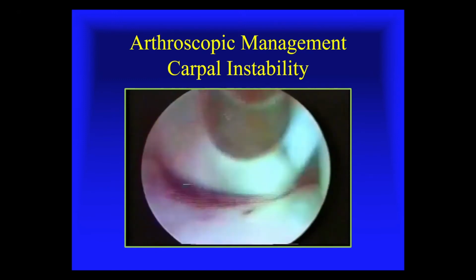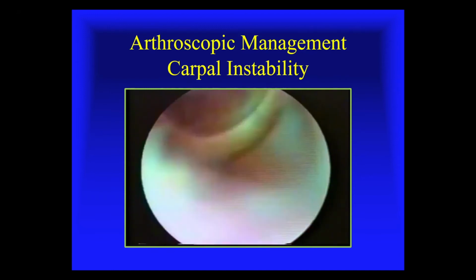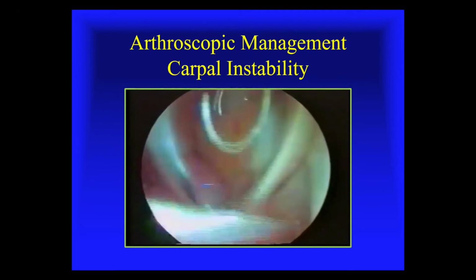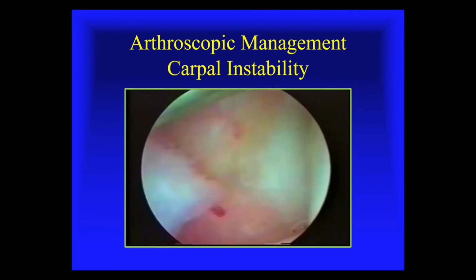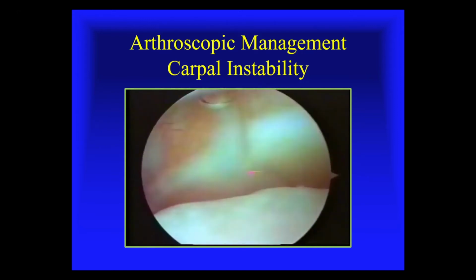You can follow the scaphoid up distally between the scaphoid and capitate and see the STT joint. Sometimes there's some air bubbles there. You can pop them loose with a needle. But you can easily see the trapezoid and trapezium with a scope in the radial midcarpal portal.